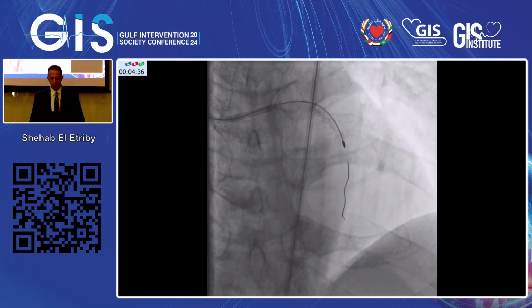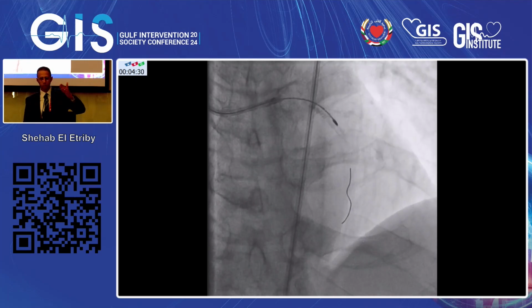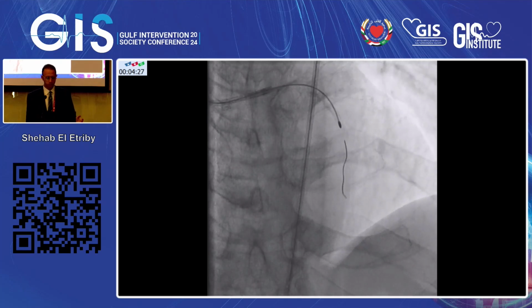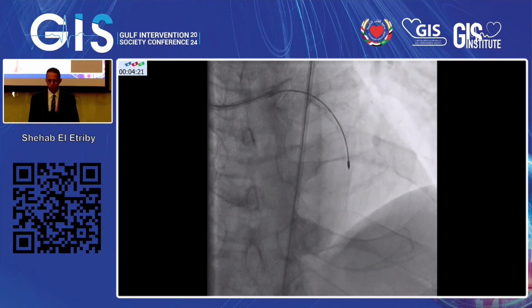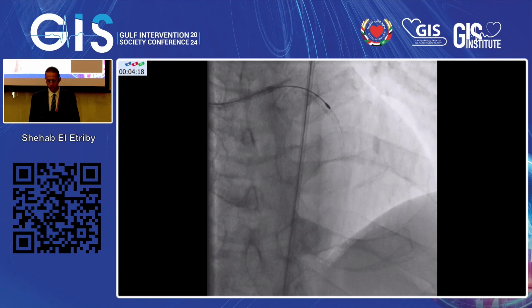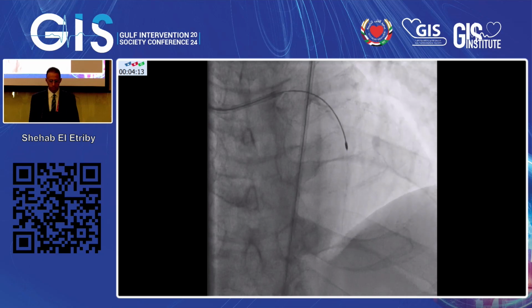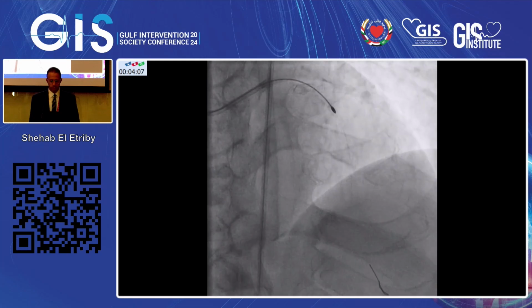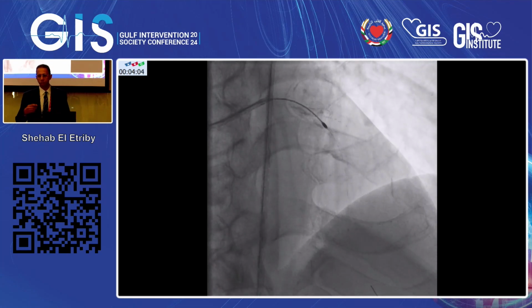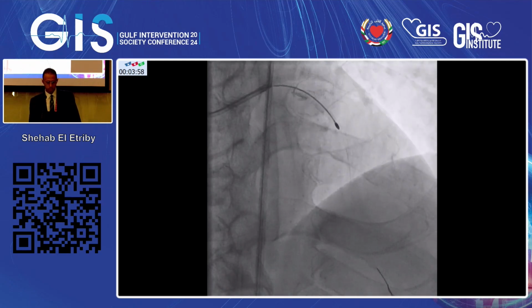Then, actually, when we passed a 1.5 rota burr, it couldn't pass, and as you see, the rota wire migrated proximally. So we entered again and put it distally, and it couldn't pass the 1.5. So we took a 1.25 rota burr. It passed after 3 times of manipulations. This was the 1.25. And then the 1.5 burr actually passed after the third time. It was a very heavy calcification in that part. This was the final polishing run.